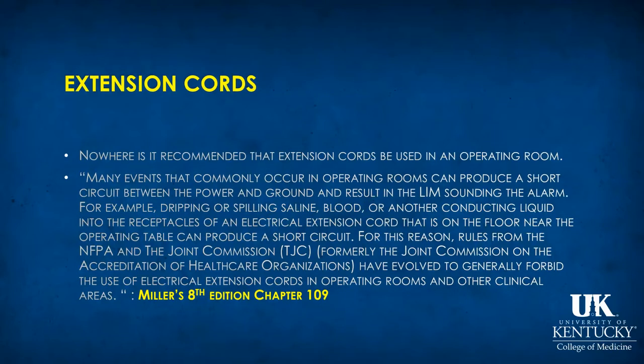Now, extension cords. Extension cords are verboten, forbidden, should not be in the operating room. Now, I know that you will see operating rooms that have extension cords in them, and they may be the only solution in some situations. However, if you speak with a clinical engineer, a biomedical engineer, you will find that there is nowhere that it is recommended that extension cords be used in an operating room. All equipment should be plugged directly into wall plugs.